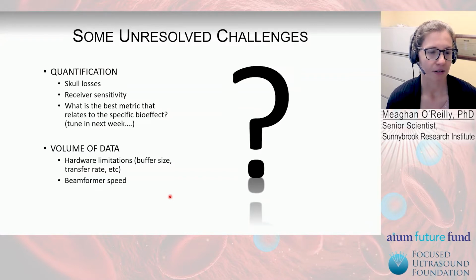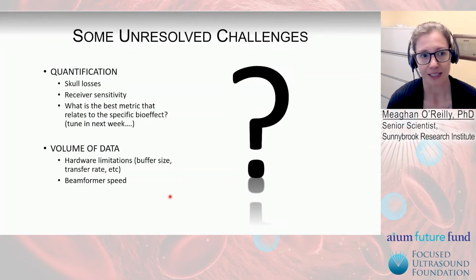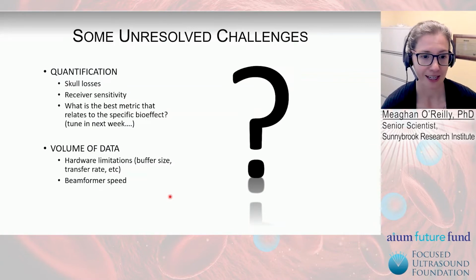And then finally, as I alluded to, with just the sheer volume of data, the hardware limitations, and beamformer speed, and being able to beamform large volumes at a real-time rate to have this be very useful in therapy. I think we're not quite there yet, but things are improving. Maybe this is a great opportunity for AI, but there's certainly some unmet needs there. With that, I'd be happy to take any questions.